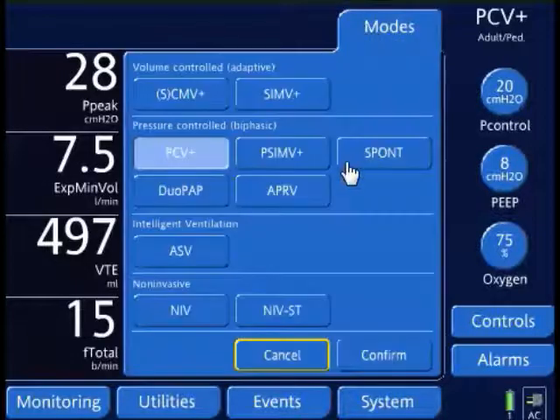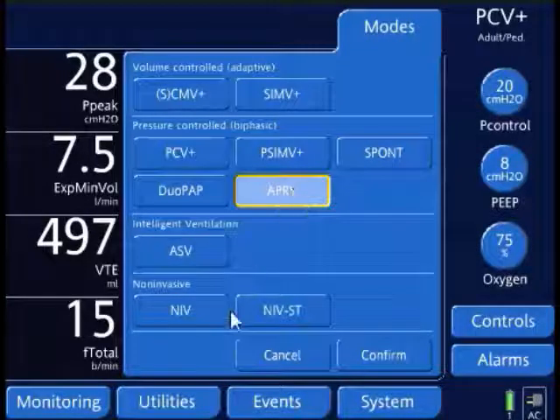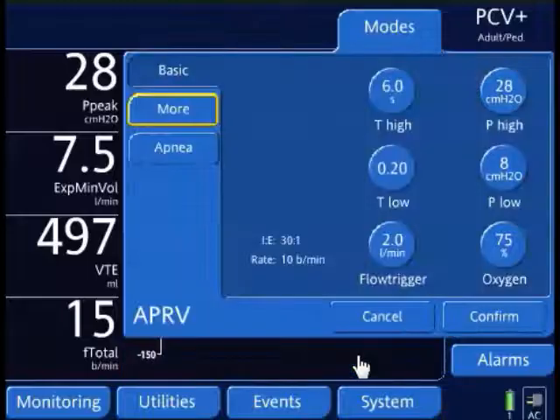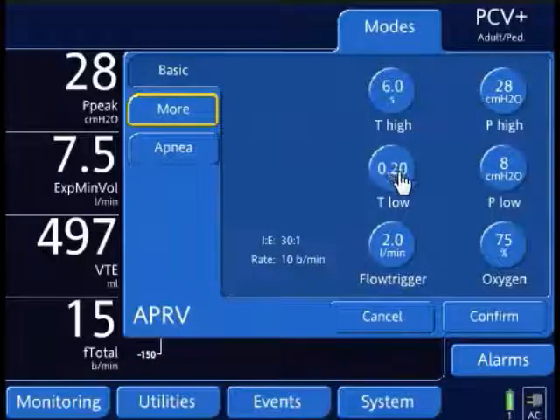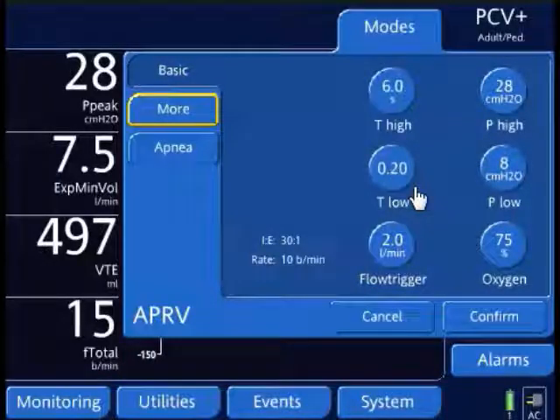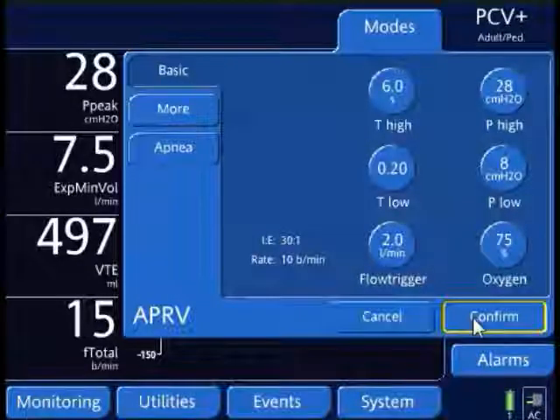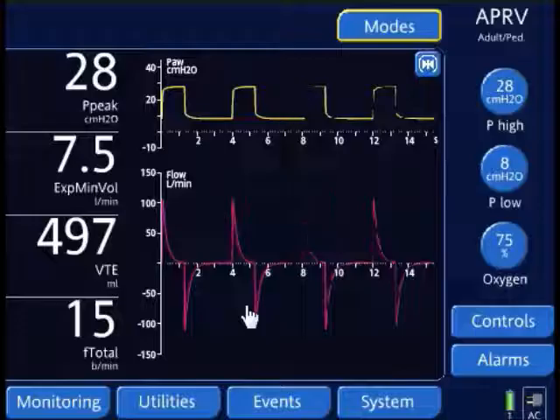Let's go back and select APRV again. I'm going to confirm that, and my T-Low is already there at 0.2 seconds. I'm just going to confirm these settings, and I'll show you what this does based on the waveform.